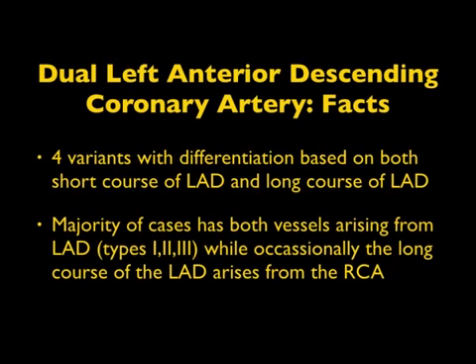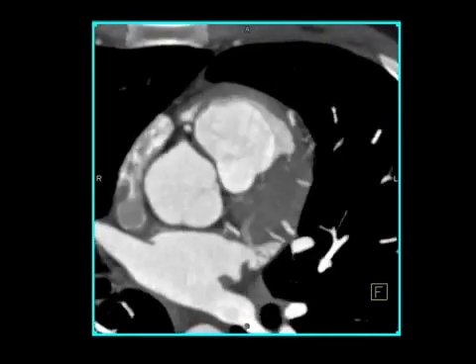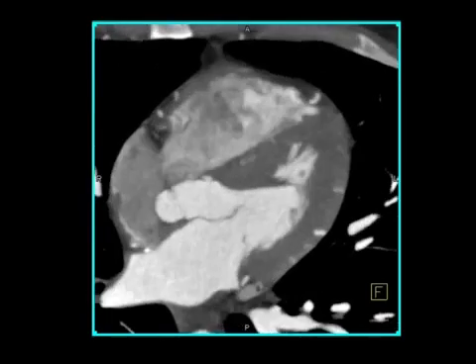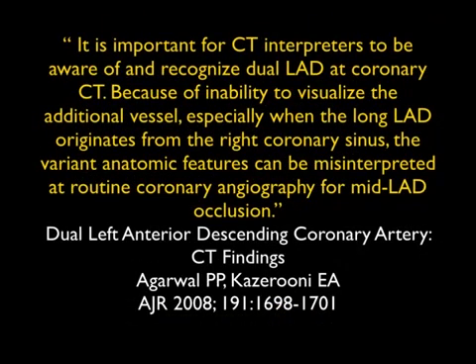When discussing dual LADs, there are basically four variations. The majority of cases have both vessels arising from the LAD, while occasionally the long course of the LAD arises from the right coronary. You can see the left main, the LAD, the circumflex, and then a vessel coming from right to left — a duplicated coronary artery. It's important to recognize this on CT because the additional vessel may be missed, and when the long LAD originates from the right coronary sinus, this anatomic variant may be misinterpreted as mid-LAD occlusion on coronary angiogram.